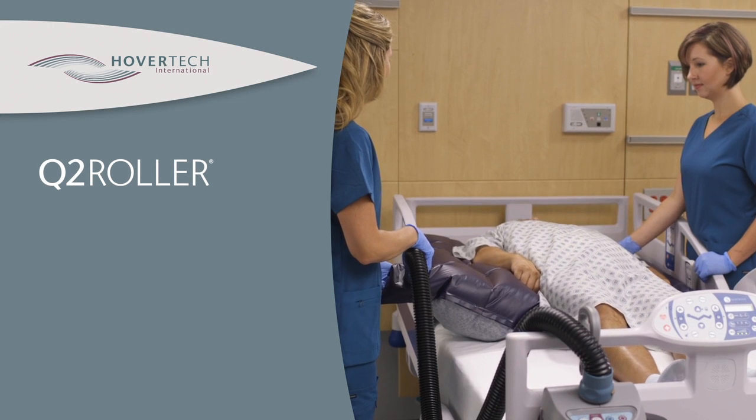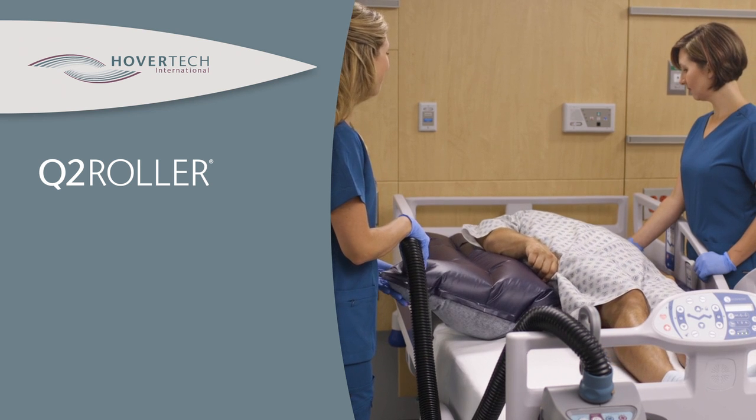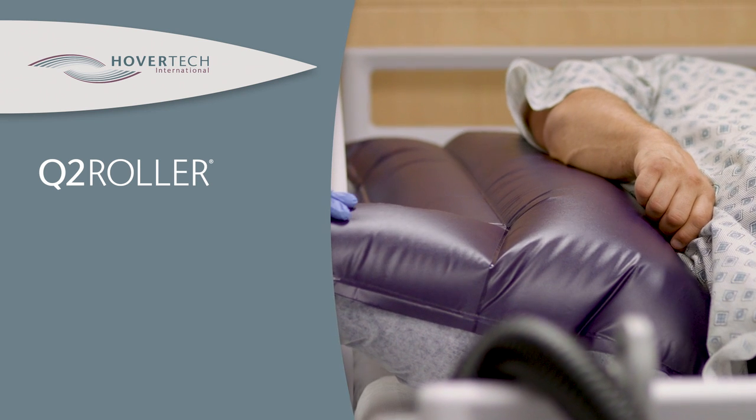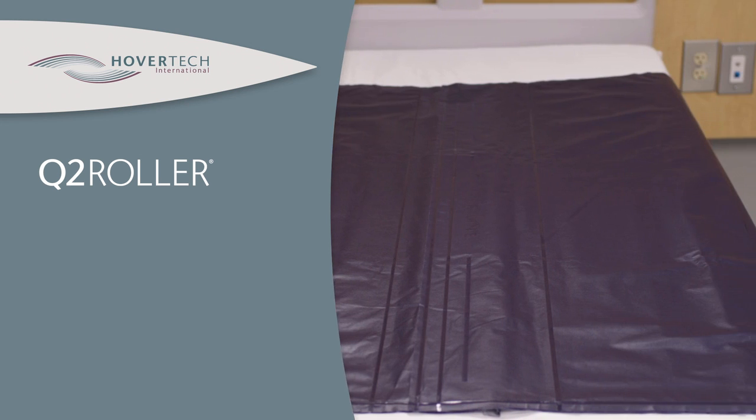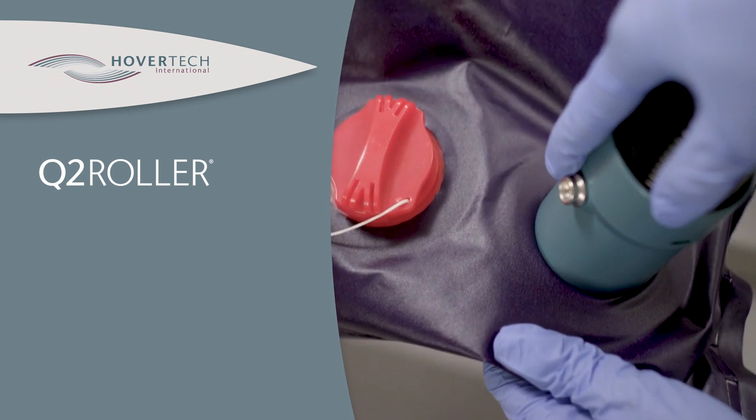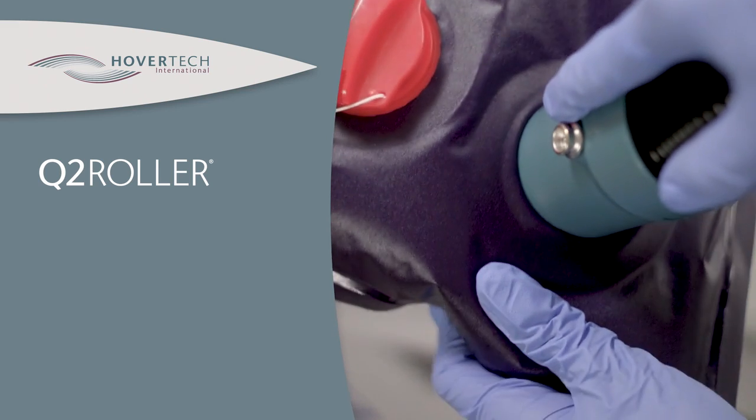The Q2 Roller is an inflatable device for the lateral turning of patients who are unable or have a reduced capacity to assist in their own turning. It is comprised of two inflatable chambers controlled by the caregiver to obtain optimal positioning for patient care.